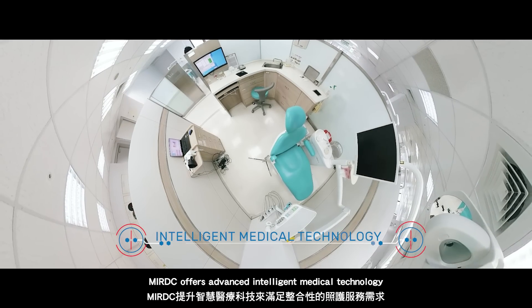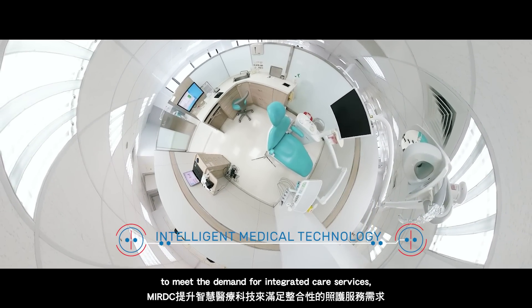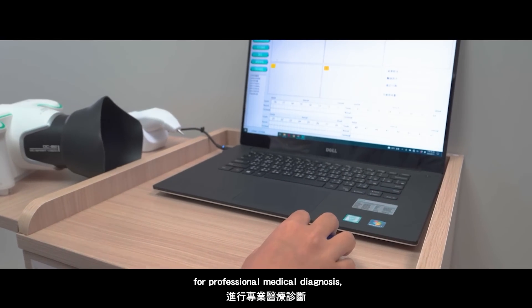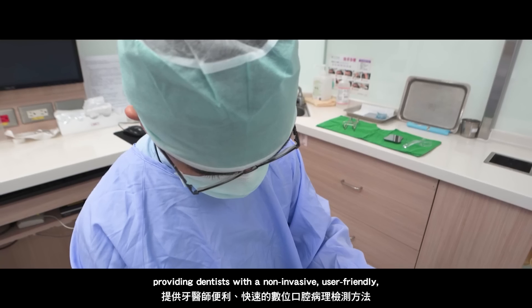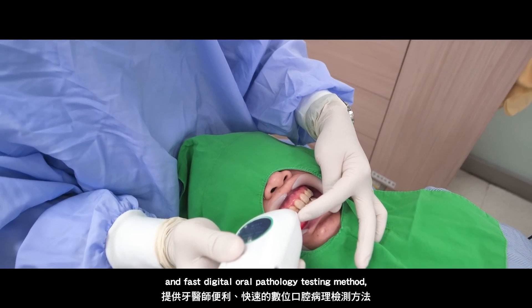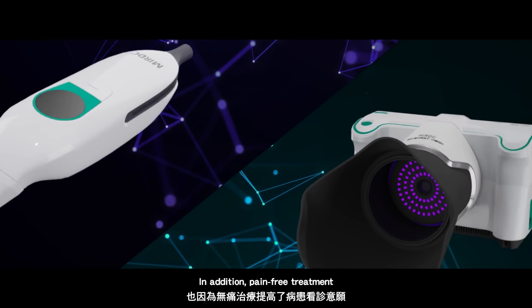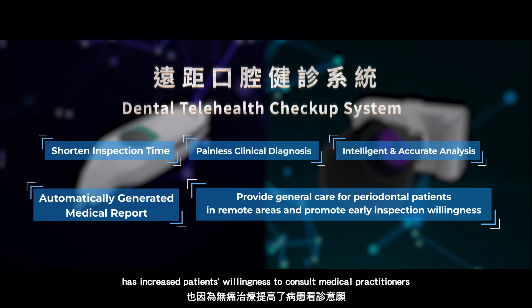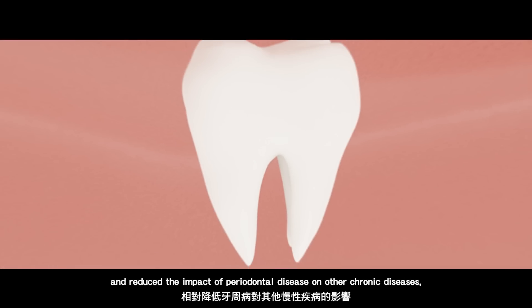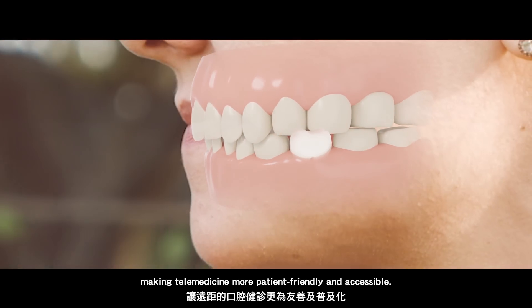MIRDC offers advanced intelligent medical technology to meet the demand for integrated care services through non-invasive inspection and data model analysis for professional medical diagnosis, providing dentists with a non-invasive, user-friendly, and fast digital oral pathology inspection method, enabling oral health care to be no longer limited by the environment. Pain-free treatment has increased patients' willingness to consult medical practitioners and reduced the impact of periodontal disease on other chronic diseases, making telemedicine more patient-friendly and accessible.